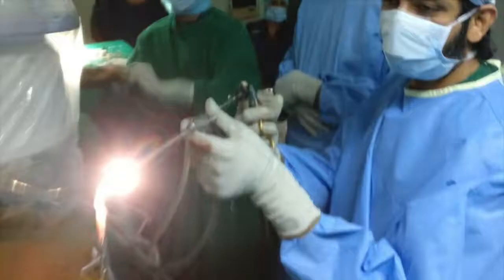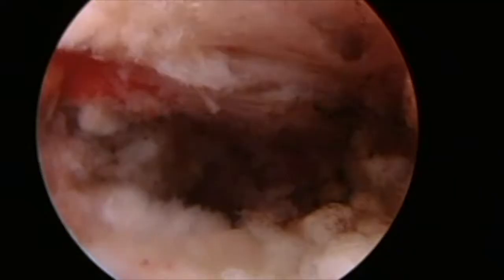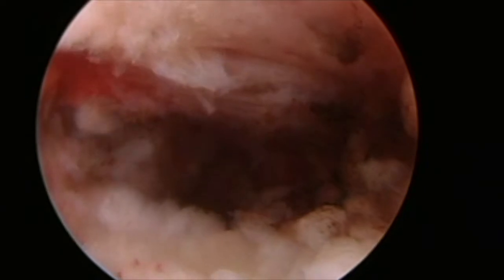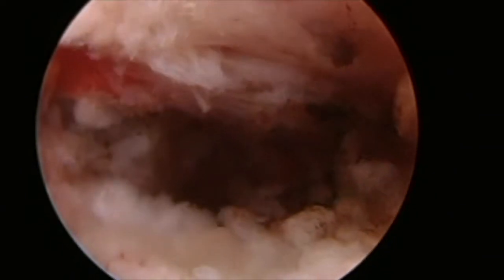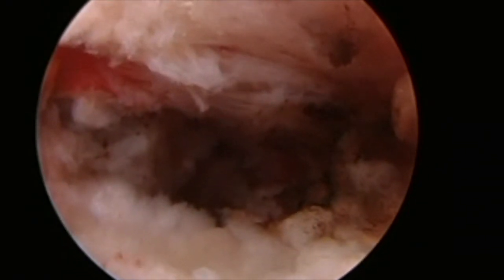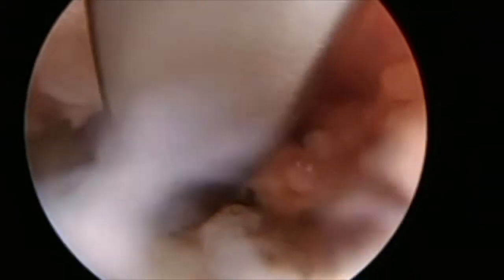One huge fragment was found. The fragment was measuring almost 5 centimeters in length, and the minute the fragment was removed, the patient had complete pain relief in his leg, and we can see the pulsations of the dura now, and also the traversing L4 nerve root, which is mobile.